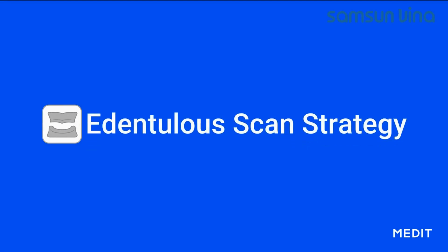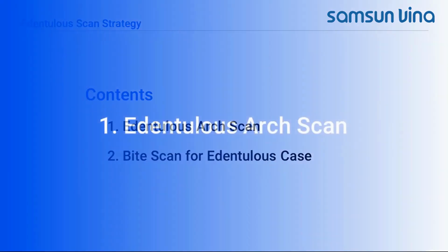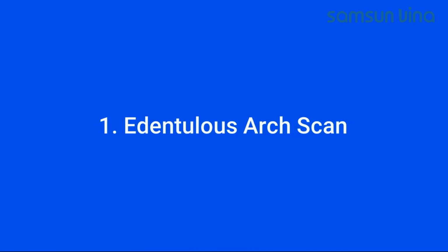In this video, we will learn how to scan an edentulous case. We will go over how to properly scan an edentulous arch and the bite scan as well. Let's start with the scan strategy.